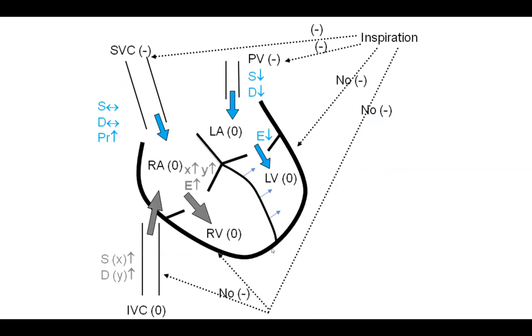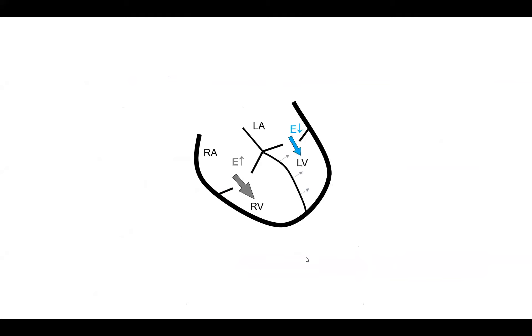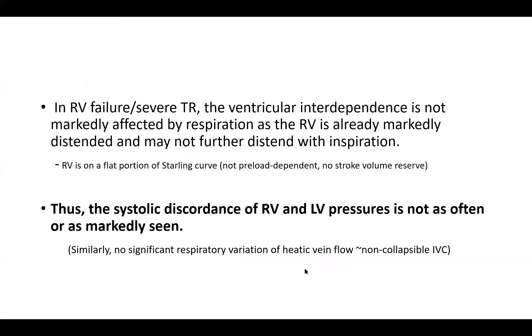I want to go back to this tracing and tell you one thing. The fact that you have such dramatic variation in RV volume — the RV is big here, so small here — just this much respiratory variation in pulse volume tells you it's highly unlikely you have right heart failure here. It's highly unlikely that you have restrictive cardiomyopathy. You have too much variation in stroke volume, therefore too much preload reserve, and therefore you're not on a flat portion of the Starling curve.